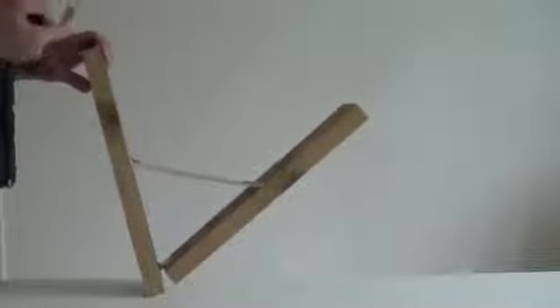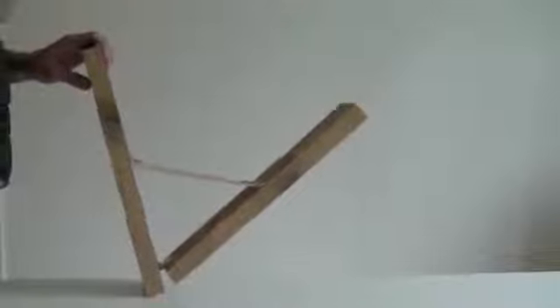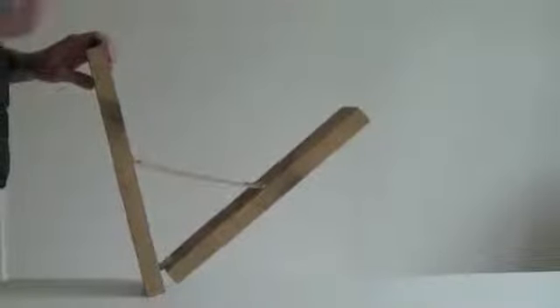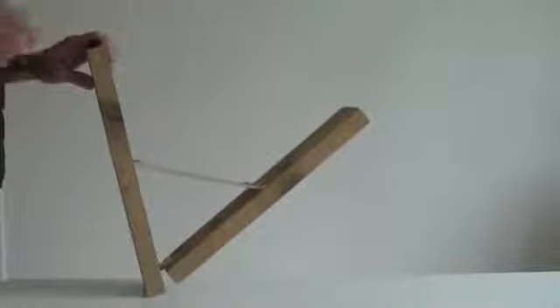It's important when you are applying your tape to pay close attention to the axis of the joint and the line of pull to ensure that you're actually introducing or contributing this force in the direction that you actually want and not in a direction contrary to work.